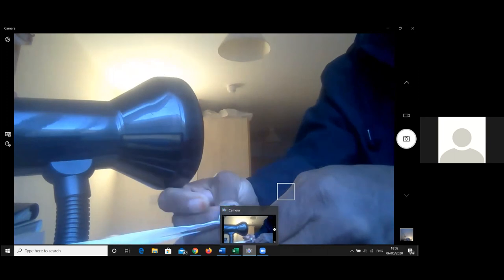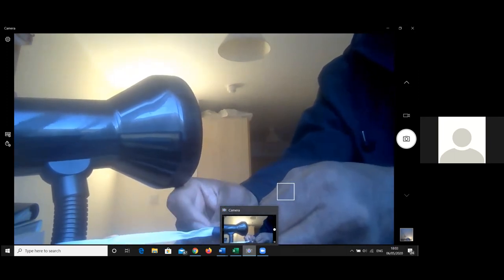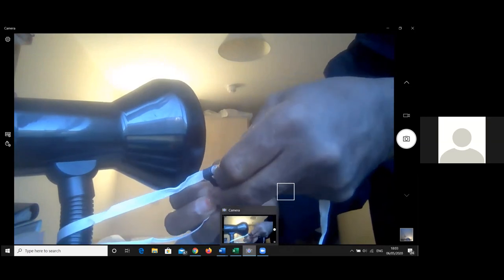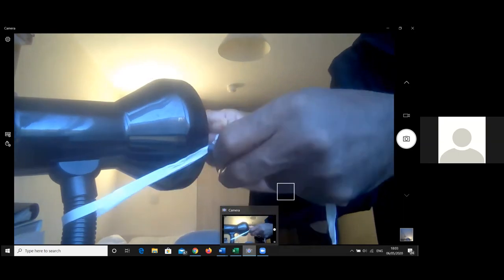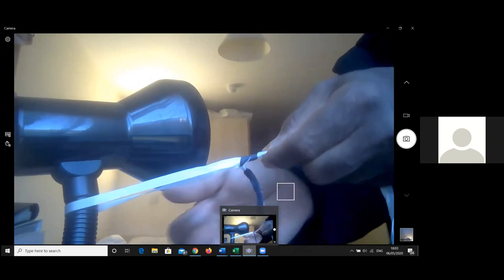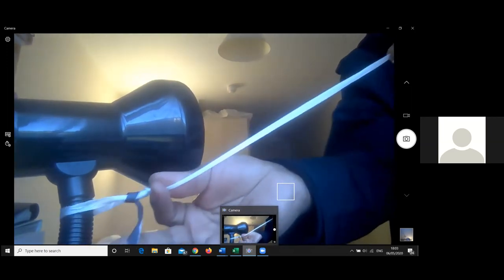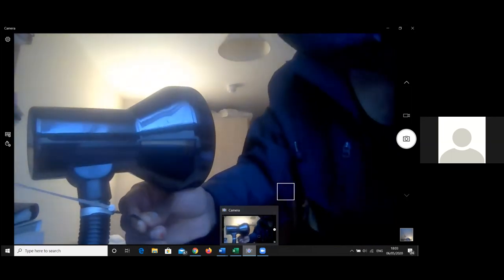Raise your arm. Raise it a bit more. Yeah, that's better. Work at that height. So now you're locking it on one side. Yes. And now you will slide. Unlock and slide. Yeah, slide. That's unlocking. Now you're sliding it through. Okay. Excellent. Well done. Unlock. Thank you.